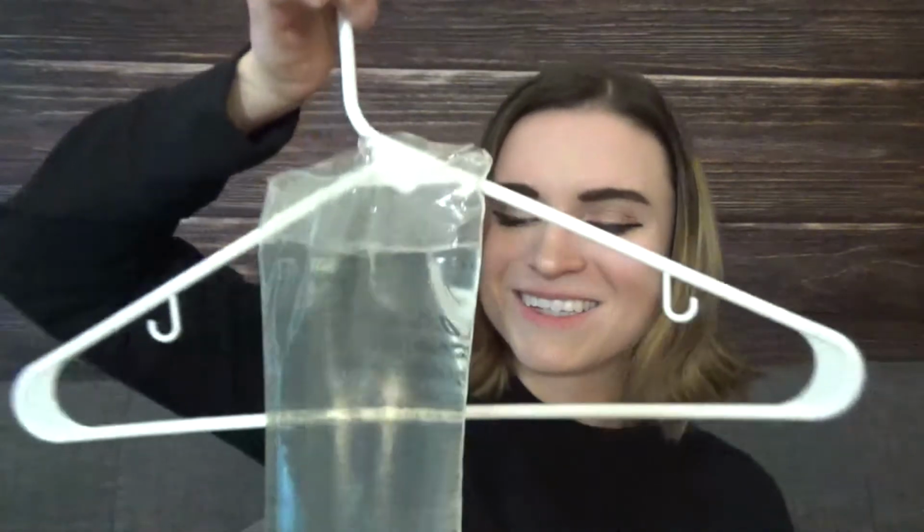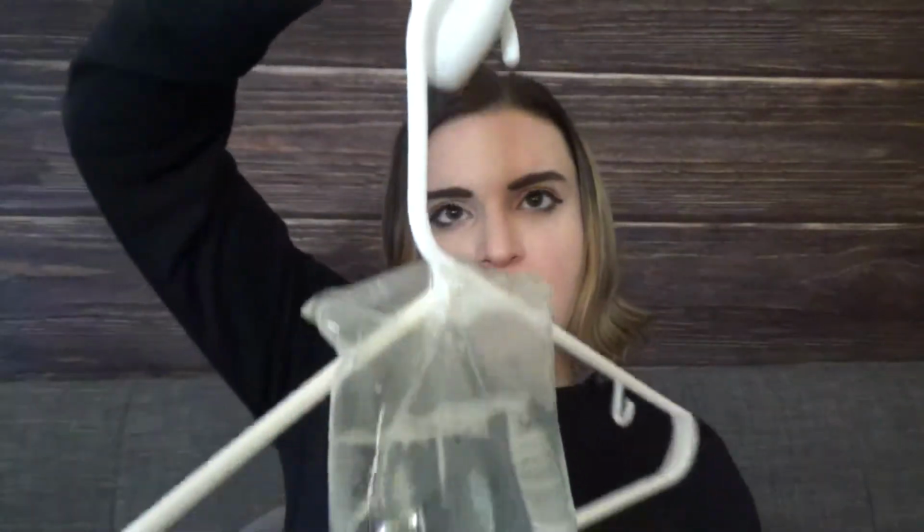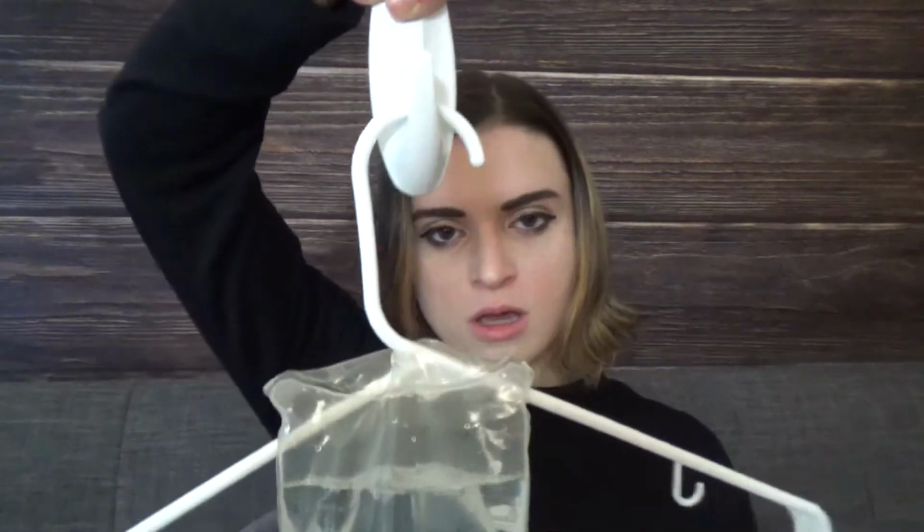But if you're just sitting there for 2 hours or an hour to get your infusion done, it's definitely worth it to not have to bring a big old IV pole that will probably be difficult to get through the airport. If you're driving somewhere, then bring your IV pole. It can't hurt. Usually hotels are fine with them, but I would definitely recommend if you're flying, don't bring the IV pole. Just do what I did with my ratchet bag hanging system, which again is just funny to me because this looks so weird, but it really works. So yeah, as you can see, this fits very well on here. It'll hold it up and you don't have to stress about not having brought your IV pole with you.